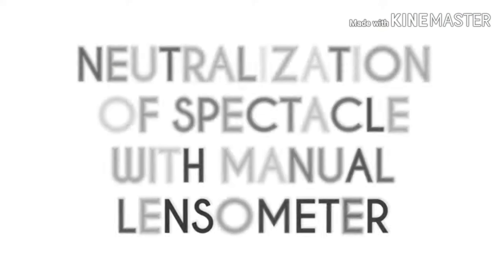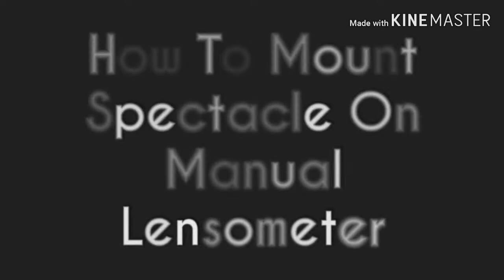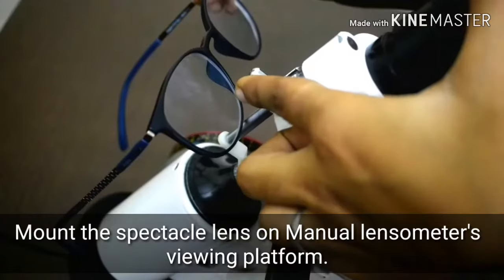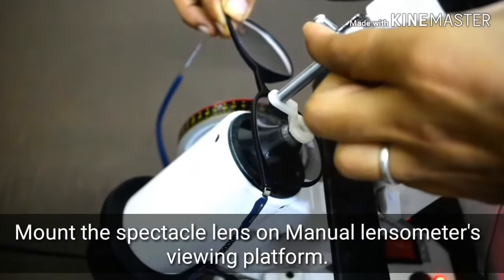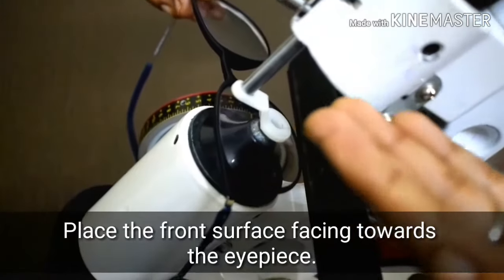Neutralization of spectacle with manual lensometer. How to mount spectacle on manual lensometer: mount the spectacle lens on the manual lensometer's viewing platform, with the front surface facing towards the eyepiece.